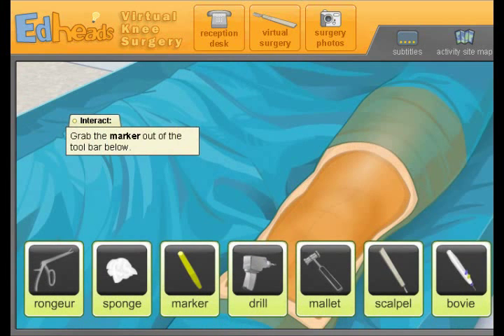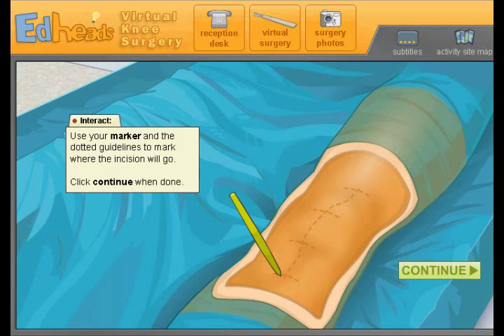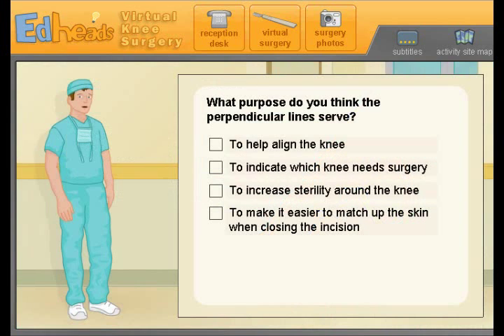Use the sterile marker to draw the location for our incision, and don't forget to mark the perpendicular lines too. Typically the incision line is six to seven inches long. Just putting a marker on it — these are going to be very important lines, these little short horizontal lines. What purpose do you think the perpendicular lines serve? To make it easier to match up the skin when closing — outstanding! Yeah, because you want those lines to match up.